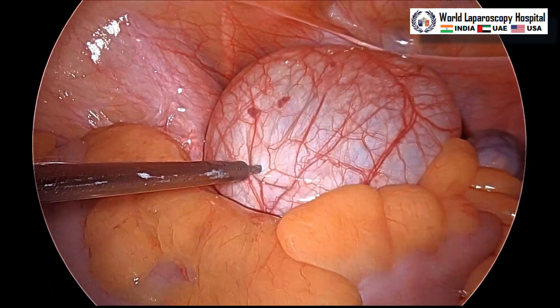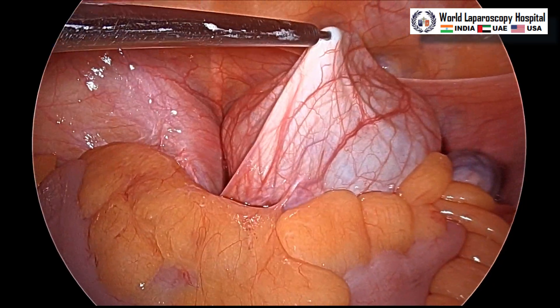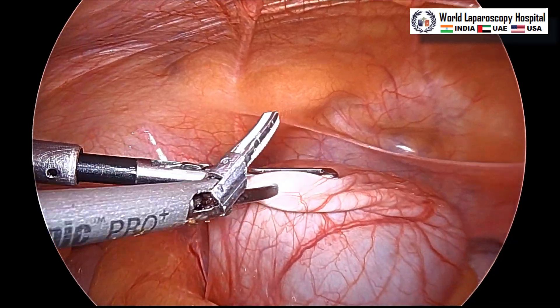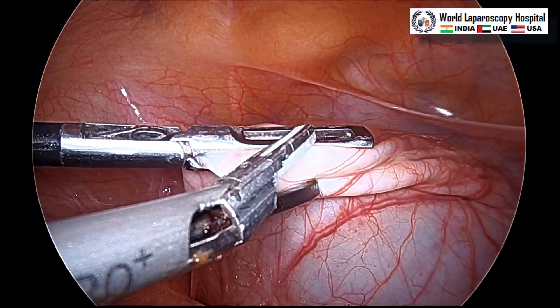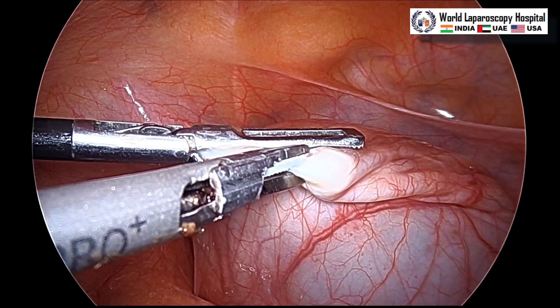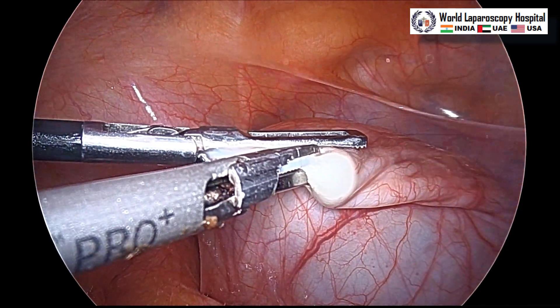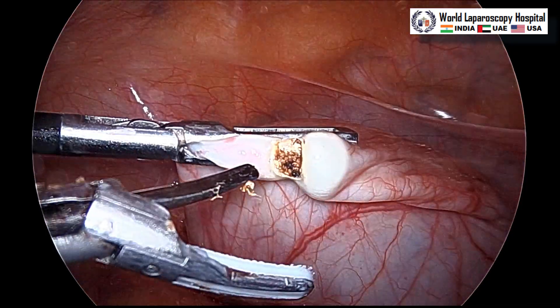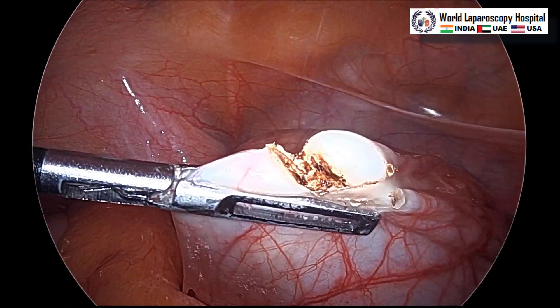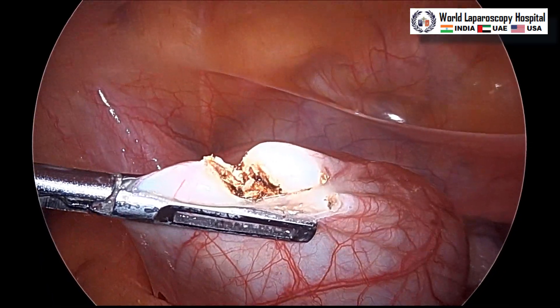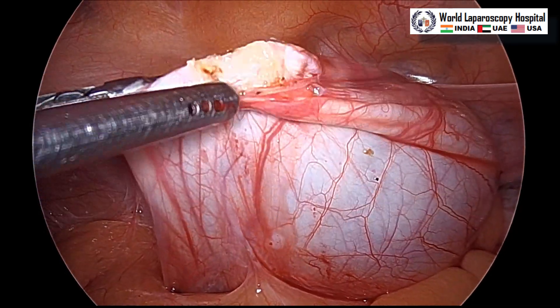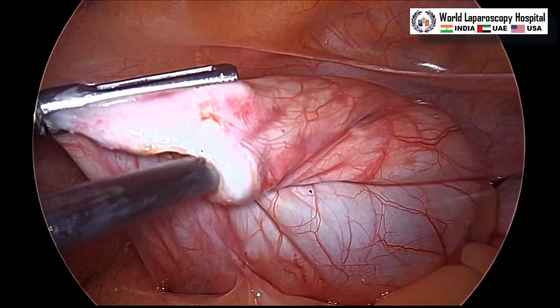After aspiration — which can be time-consuming — you can catch it with the grasper, remove the aspiration needle, and with the harmonic you can enlarge the incision a little bit so that you can use a suction. With the suction you can aspirate the fluid content of the cyst very easily and faster. A small opening was made, and now suction is going into the fluid to suck all the cyst contents.